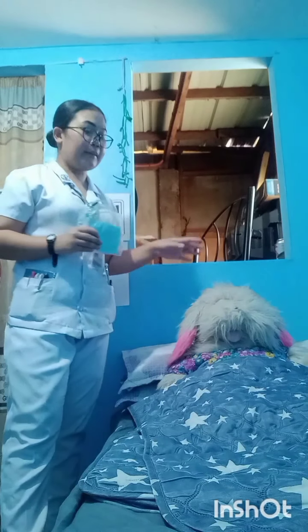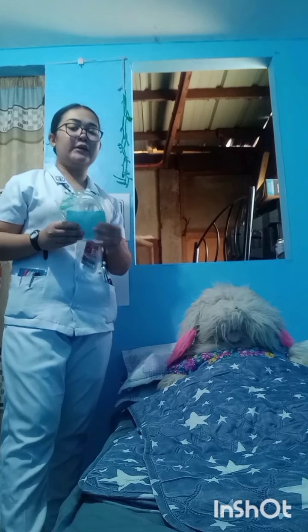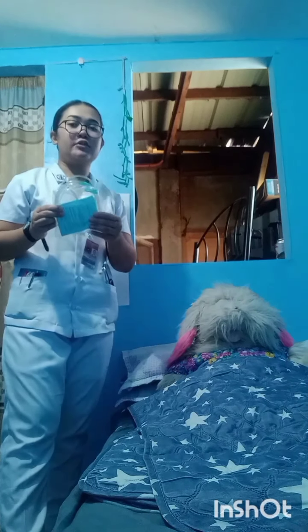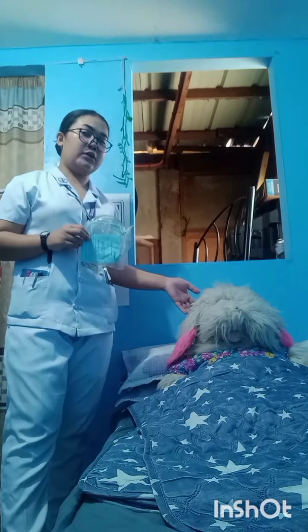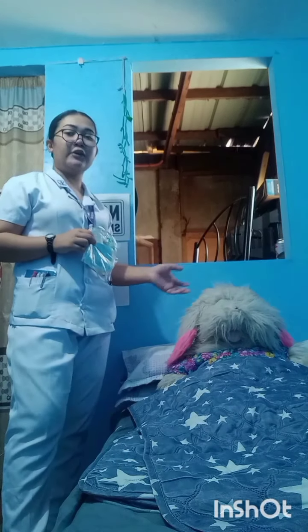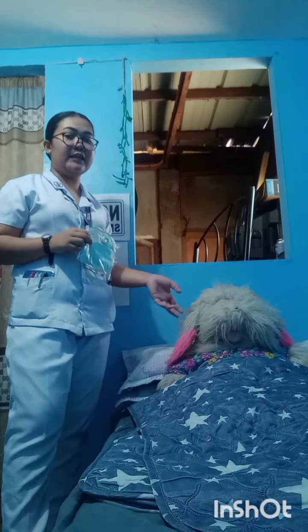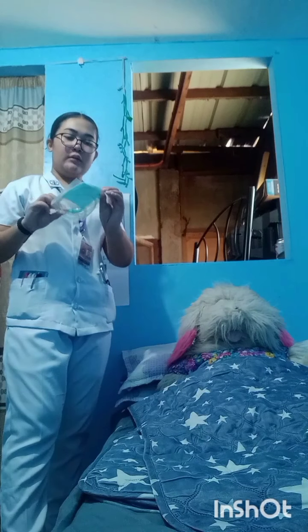Kailangan sakto yung oxygen tubing na ibibigay natin sa ating patient, because kapag binigay mo is not adult tubing, yung hindi pang adult na oxygen tube or nasal cannula, hindi makakaginhawa or hindi mabibigyan ng adequate oxygenation yung patient natin. Hindi sakto. So, ito yung nasal cannula or oxygen tubing, ilalagay ko sa aking patient. It is for adult.